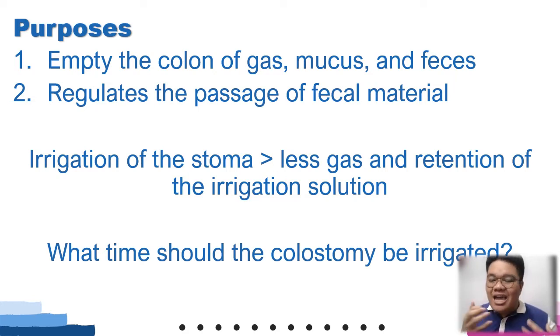So class, what time of the day should the colostomy be irrigated? It is best for you to irrigate the colostomy depending on the schedule of the patient. What do I mean by that? If the patient would usually poop in the morning, it's best for you to irrigate the colostomy in the morning.